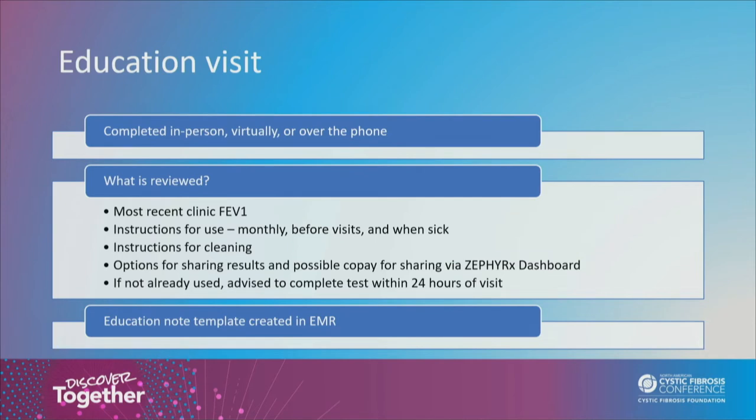We also discuss options for sharing their results with the patient. We inform the patient there may be a copay for sharing via the ZephyrX dashboard, and that sharing is optional, not required. Lastly, we advise the patient to set up and use their device if they haven't already within 24 hours of their visit. An education note template was also created in EMR.